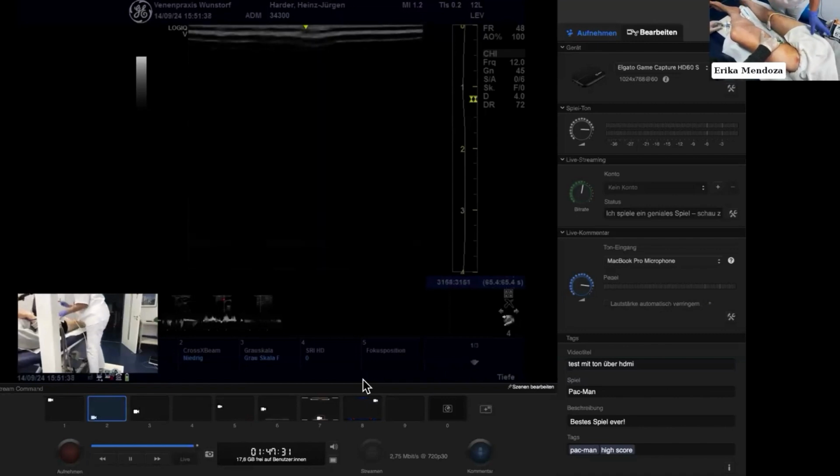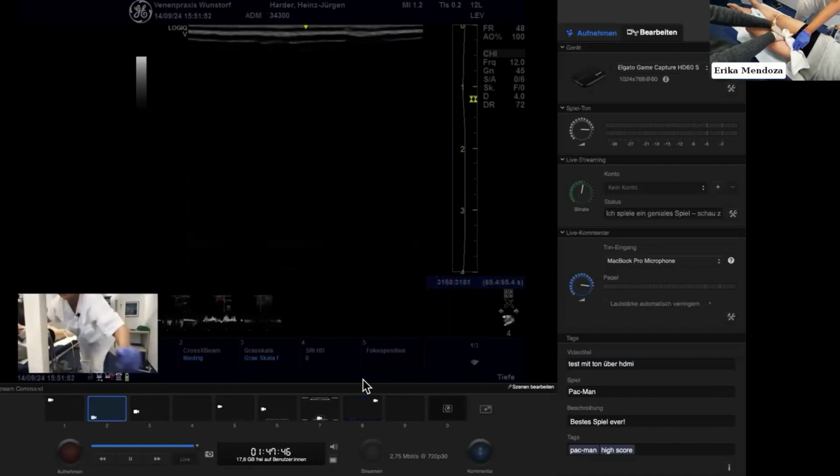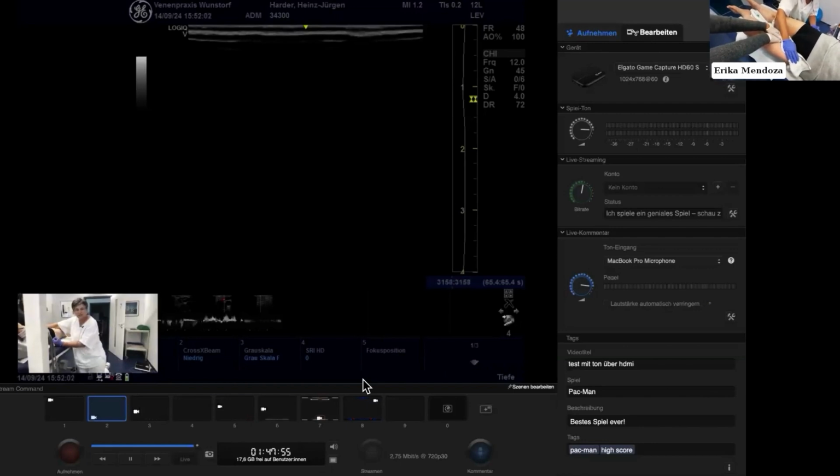And what I do now, because I'm happy, I do like this. I take this out, come here, compression. Yes, I do. And I compress here, very relaxed. I stand and talk to the patient and put my body weight on the leg, just to make sure there will be no reflux into the just-treated area.